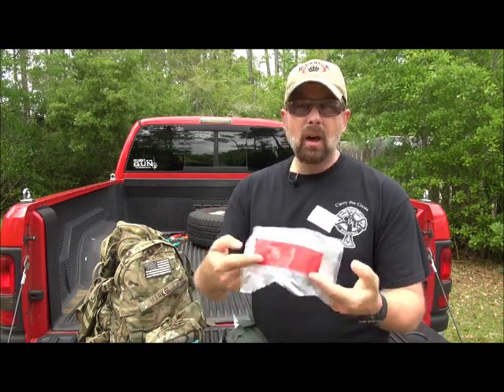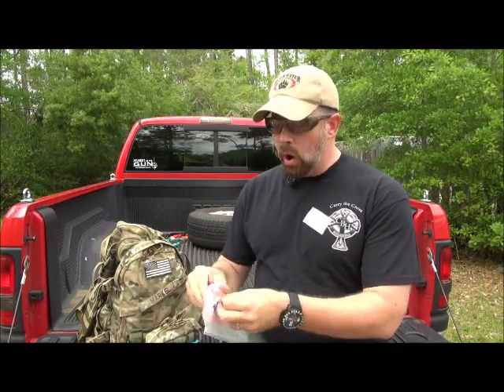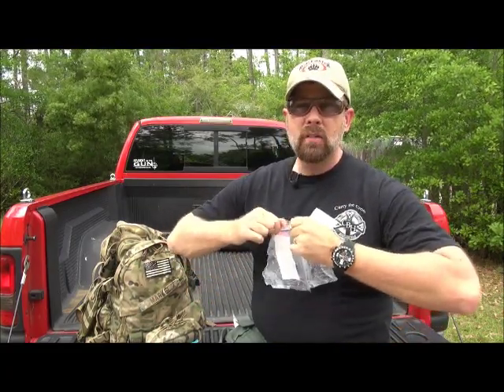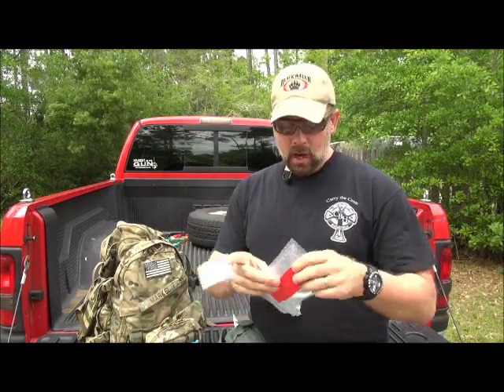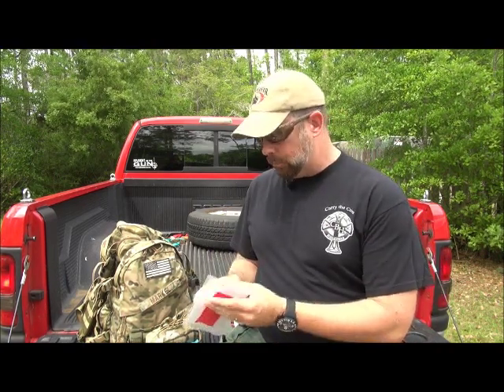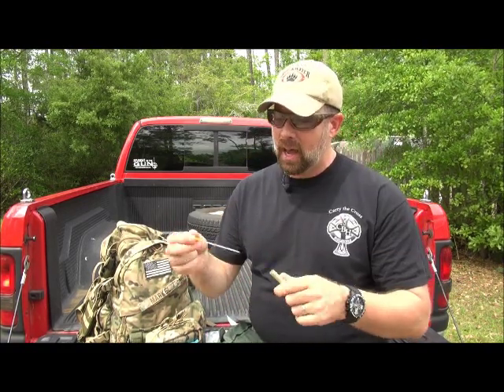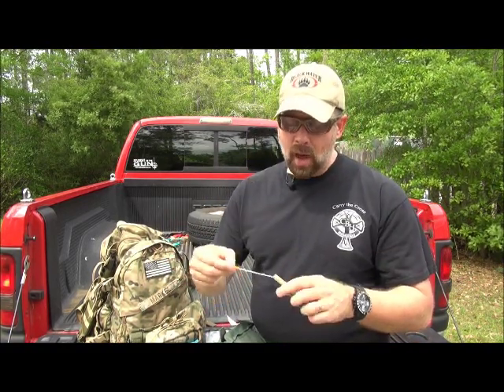Once you put the bandage on, if you want to secure the bandage with the tape, you just put the duct tape on the outside of the package and it stays there. And what else do you have? Well, I've got my plastic, so if it's a big hole, bigger than what the tape can cover, you can put your plastic right over there and seal the hole in the chest. So real quick, oh, almost forgot guys, our decomp needle. If you have a no kidding tension pneumothorax developing, you've got to relieve it somehow.